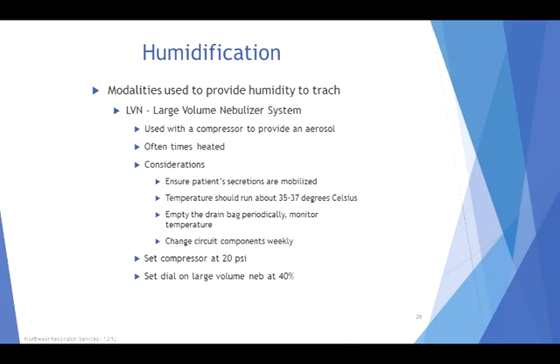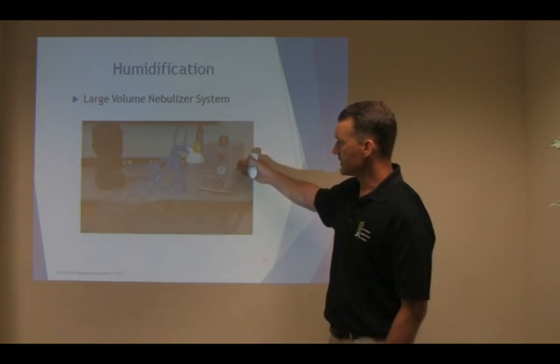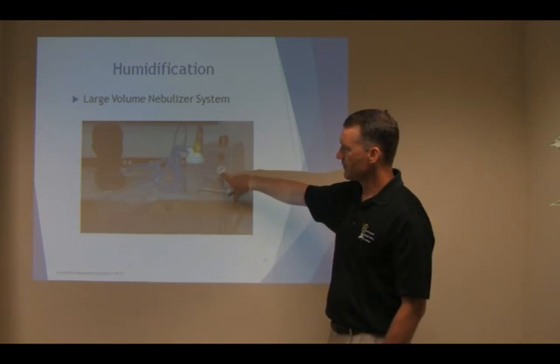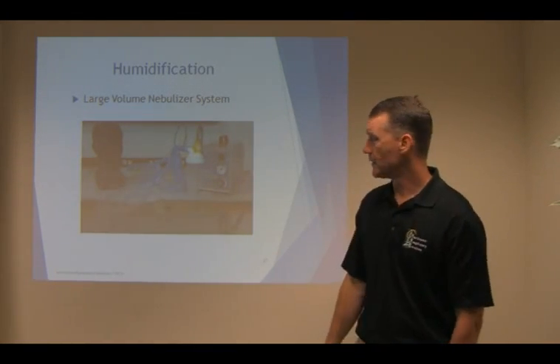Set our compressor at 20 psi. Set dial on large volume nebulizer at 40%. Here's your nebulizer setup system. This is the Easy air compressor, and here is our pressure dial. Again, we don't want this at any higher than 20.